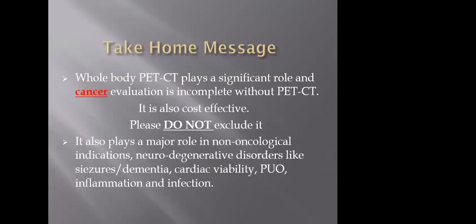Also, it plays an important role in non-oncological indications like neurodegenerative disorders, seizures, and dementia, which I haven't touched upon because of time constraints.